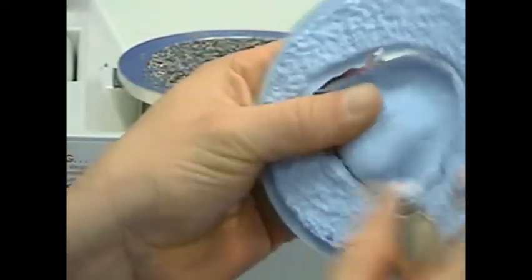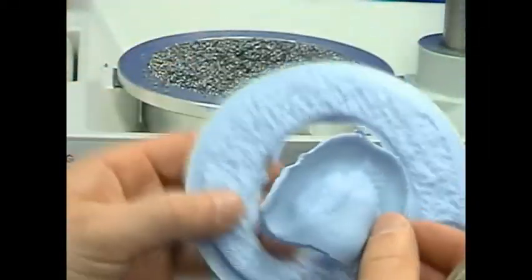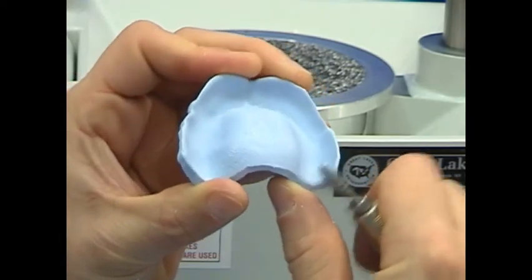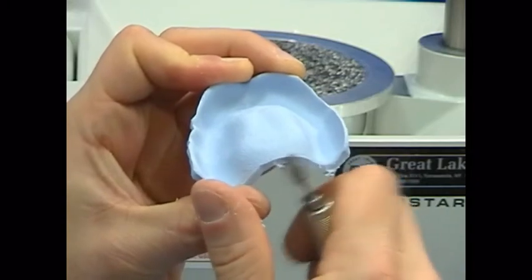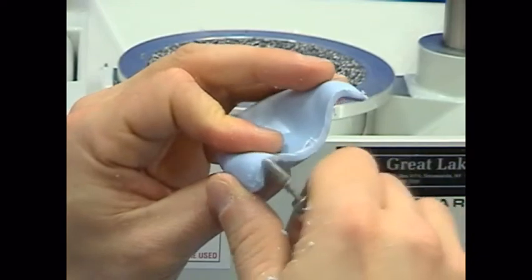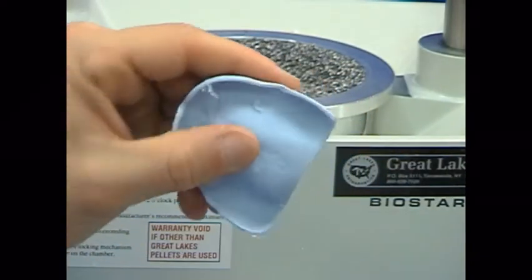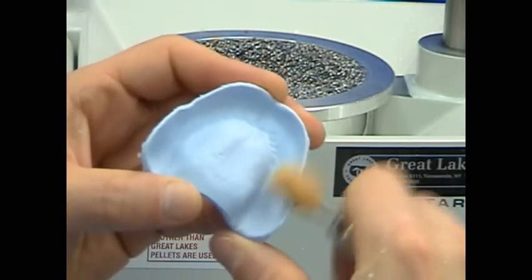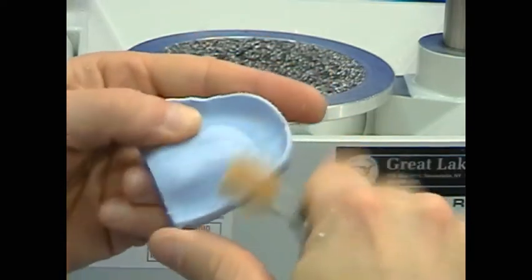Remove the cut tray form from the plastic disc. Using a carbide taper bur and a lab handpiece, tailor the tray borders to follow soft tissue contours along the model base. Then, with a sandpaper mandrel and a 3 inch strip of 150 grit sandpaper, smooth the trimmed borders.